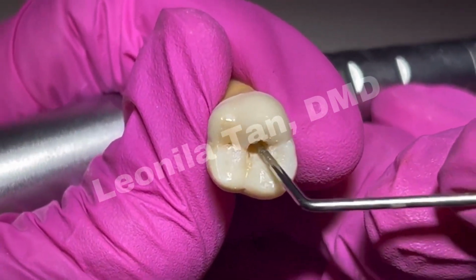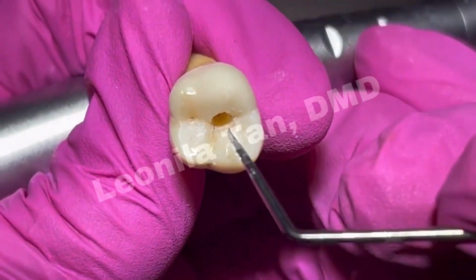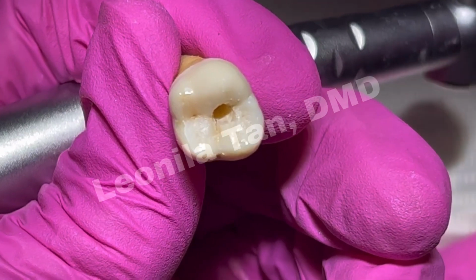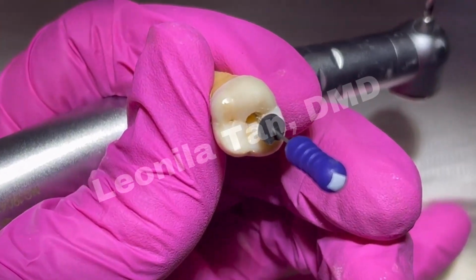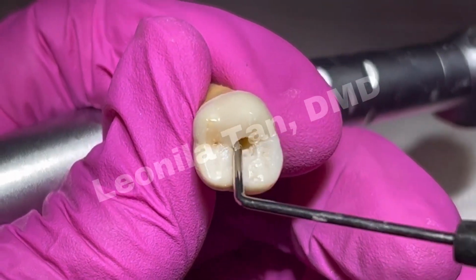So here, I feel I'm already very near the drop, or if not, with my probe I believe I'm able to enter. Let's check if it does go in. Yeah, it goes in. Notice as you enter, it's very important that you frequently probe.